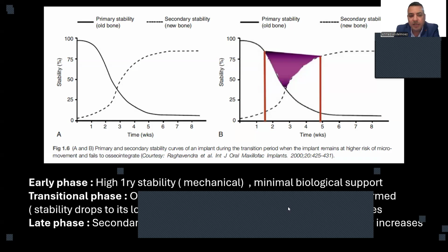Further, during the biological process of osseointegration of the implant, the bone physiologically changes during multiple phases of bone resorption and new bone formation over the implant surface, and any micro movement of the implant during this phase may lead to failure of implant osseointegration.